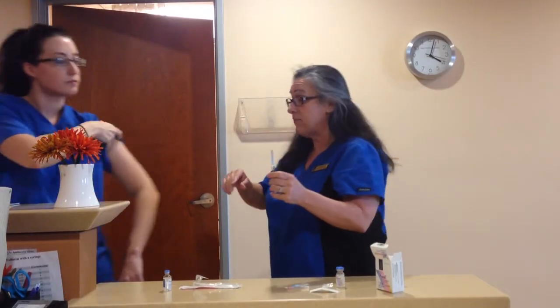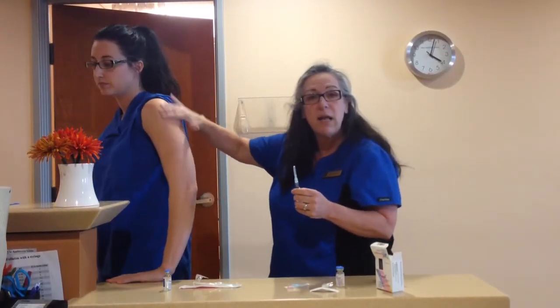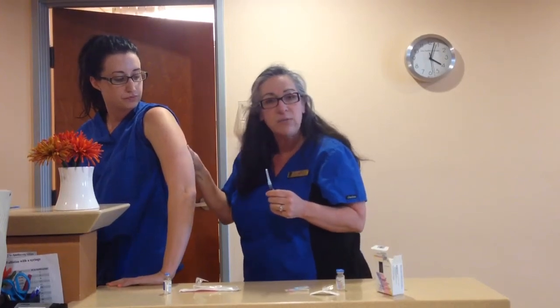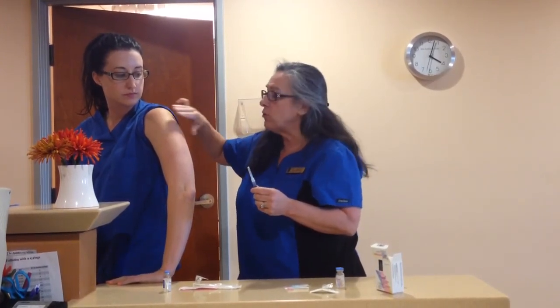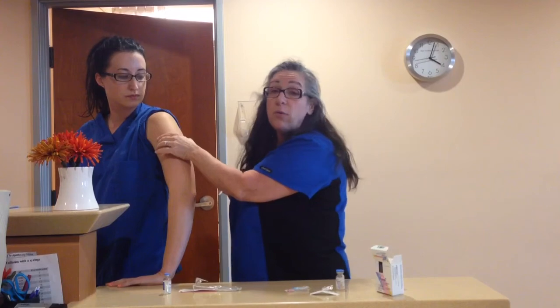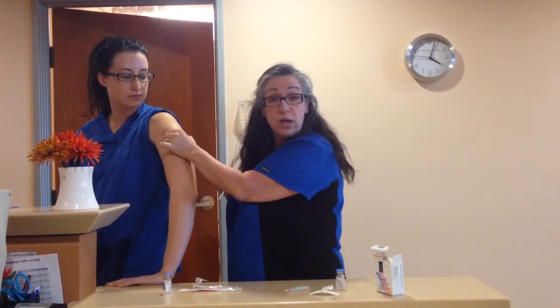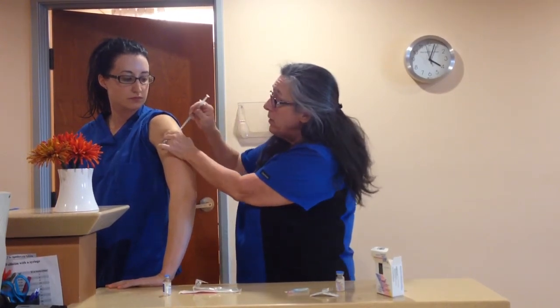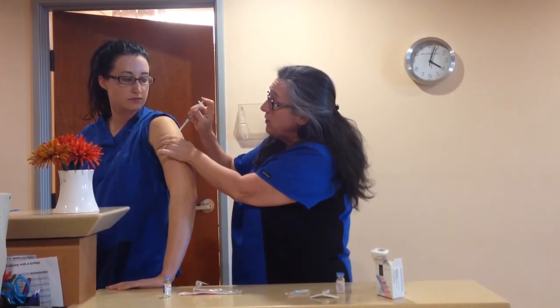Let me show you how Dr. Schur's patients do this injection — it's going to be a deltoid injection, and I'm going to have Sam help me out here. This is your deltoid muscle right here, kind of like when you get a flu shot. It's that big muscle right underneath the shoulder, about three fingers right below the top of the shoulder. Use a little alcohol swab to clean the spot — you can inject anywhere in a big circumference right here. Just like your subcutaneous shots, pinch up and inject: needle in, plunger down. I don't need to aspirate — it's a smaller muscle, nothing fancy. Pinch it up, needle in, pretty much all the way, inject, and we're done. That's how simple that injection is.